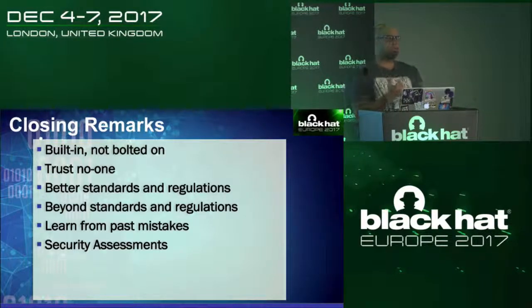Finally, manufacturers should get a security assessment done on their medical devices. Best would be right from the design phase. But if manufacturers are not getting that done, if you think that manufacturers are lazy, then medical institutions should push their manufacturers to get it done, or ask for a security report when they buy the product from them.